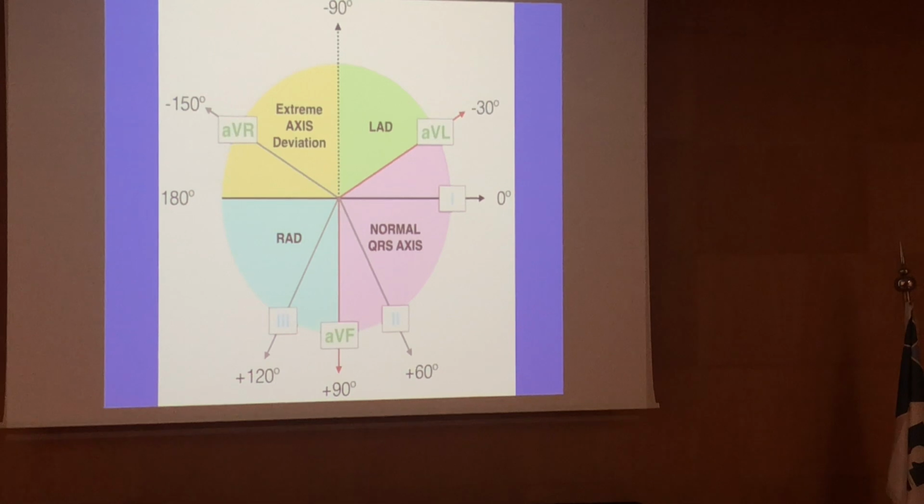We cannot tell. And this is most of the time we see it with ventricular tachycardia when the activation is totally abnormal. And once we see somebody axis in this area, we think of ventricular tachycardia because it's not physiological at all. It cannot happen even with just minor changes like with myocardial infarction or other things that can cause left axis or right axis deviation.